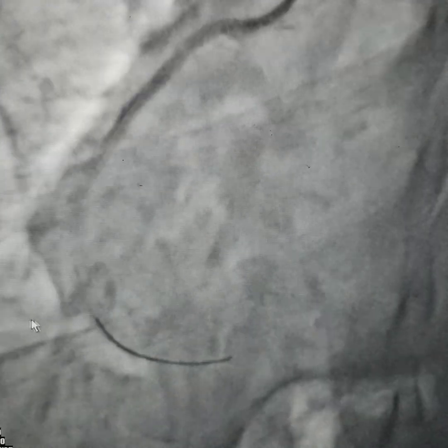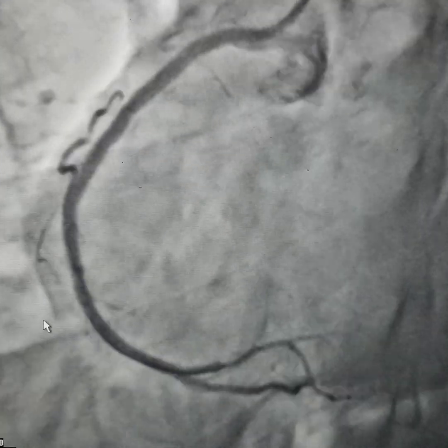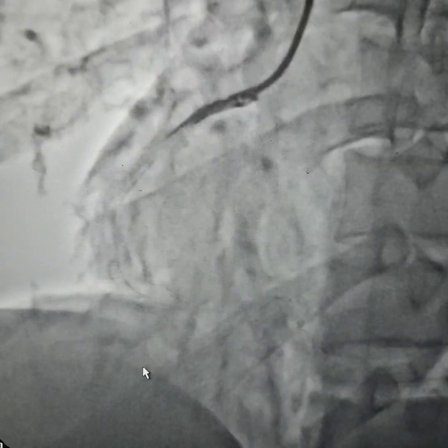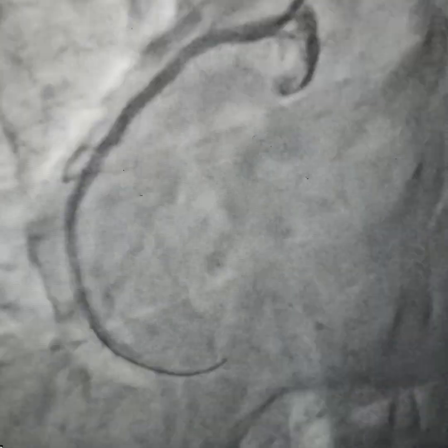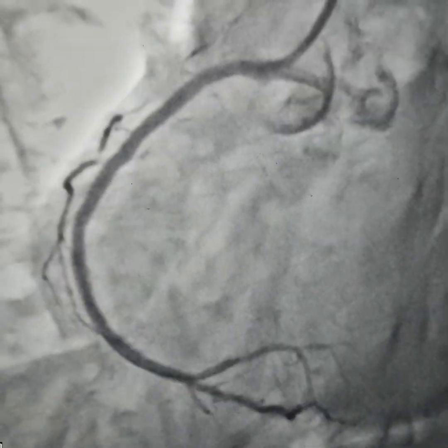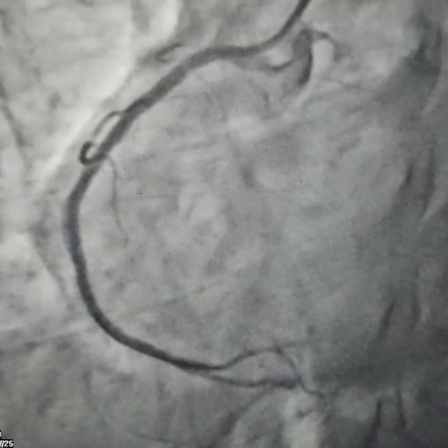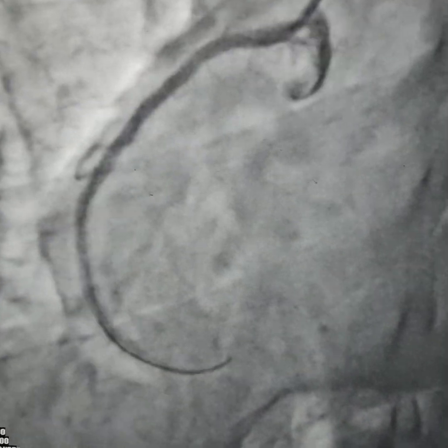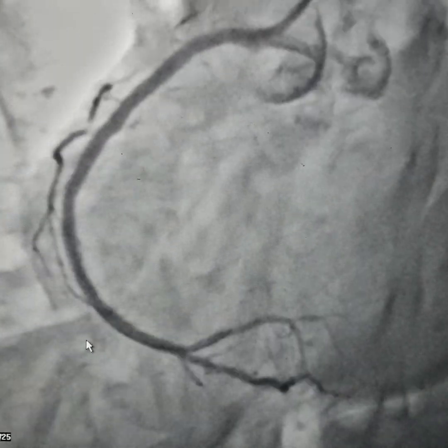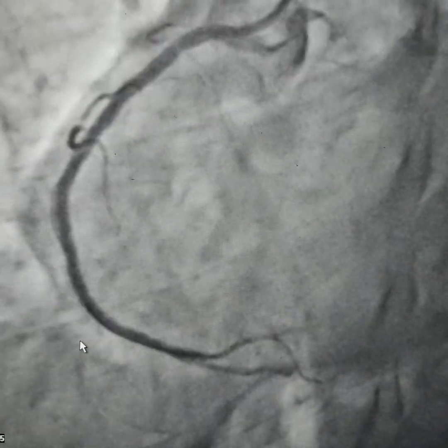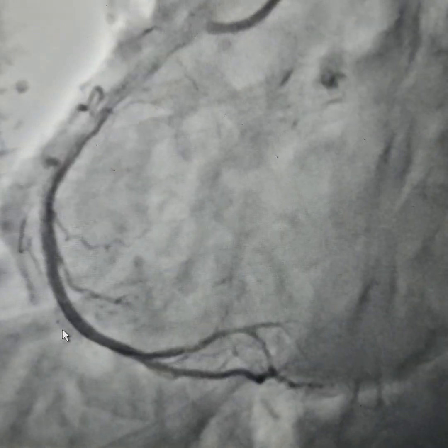This is the final result — a wonderful artery with good flow. The patient is chest pain free and has been discharged after about 24 hours. His angina has definitely reduced and we hope he continues showing such recovery in the future. Thank you — Agra Heart Center.